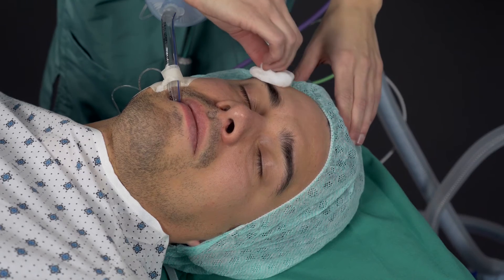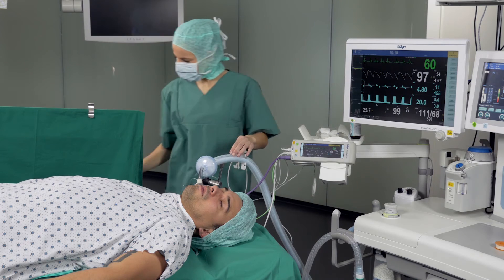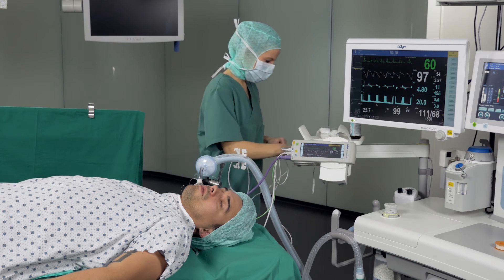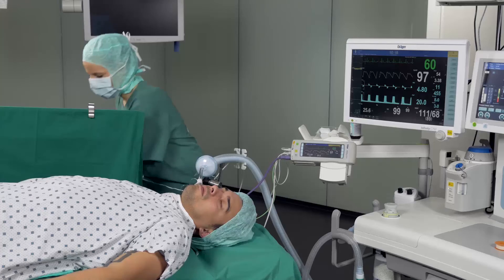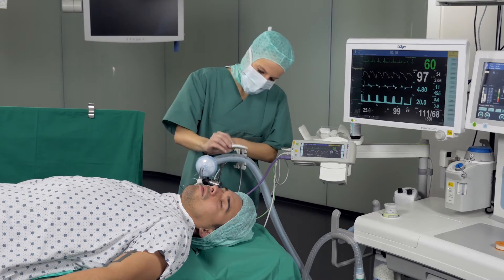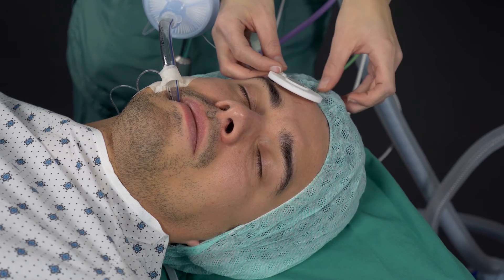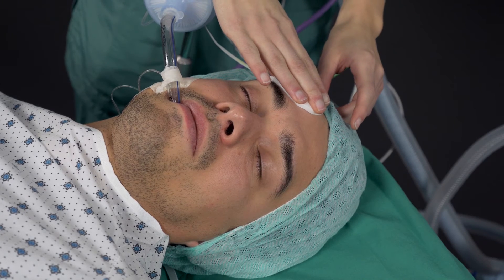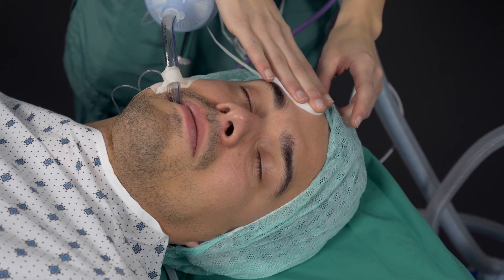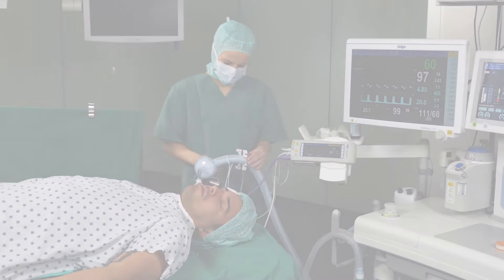The Drega T-core sensor is quick and easy to apply and thus offers a good alternative to invasive core temperature measurement methods. For continuous consistent core temperature monitoring in the OPE area, the sensor can be applied already during the anaesthesia introduction phase of the patient and then may remain attached to the patient's forehead until after the operation. The T-core sensor thus actively contributes to preventing hypothermia in the patient during the entire OPE process.